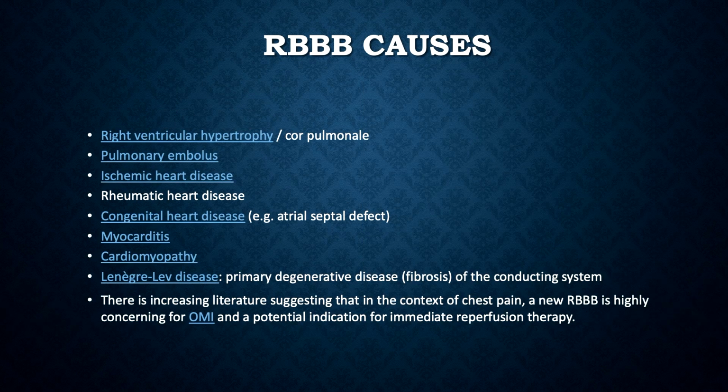So what causes a right bundle? Anything that can cause strain on the right side of your heart. So, for example, massive PE. Now, I do want to warn you, just because someone has a right bundle does not mean they have a PE. But if your patient doesn't have an old EKG, or they say, I've never heard of a bundle branch block, or they don't know what that is, or say this looks different than the old EKG, and then let's say they're having severe dyspnea that was sudden onset, they've recently had surgery, everything's pointing towards PE, and you have a right bundle, that should make you a little suspicious, right?